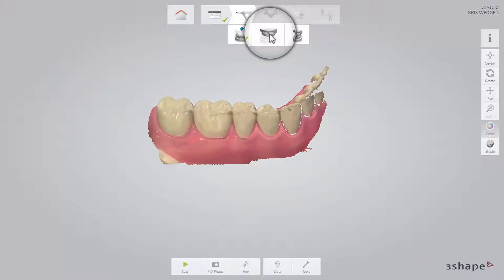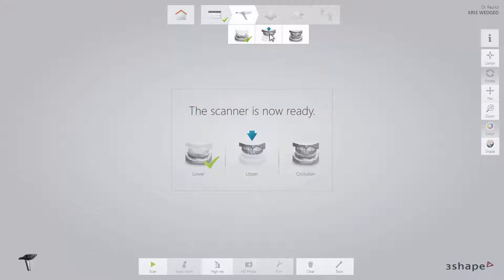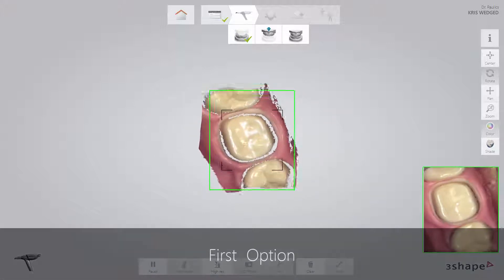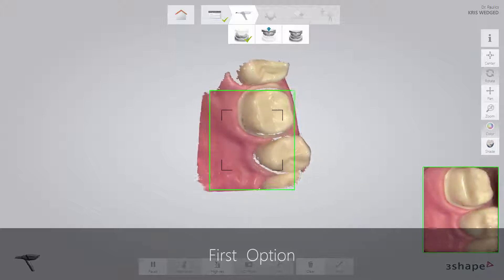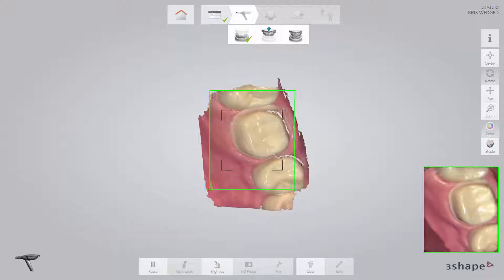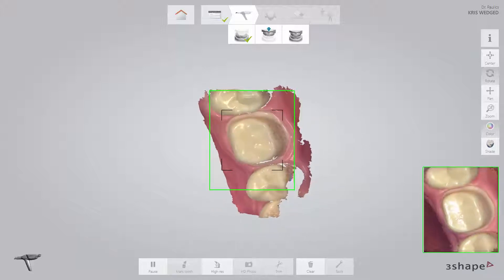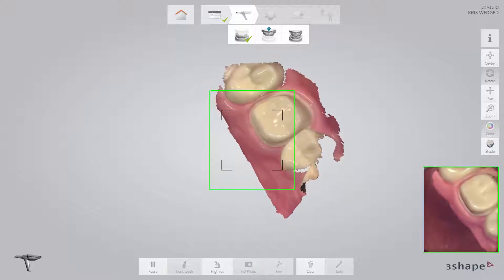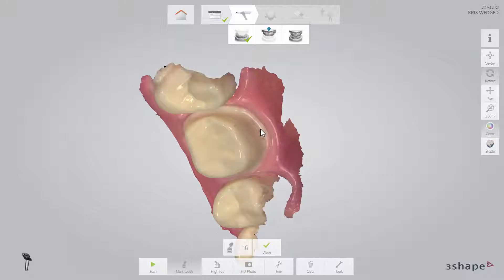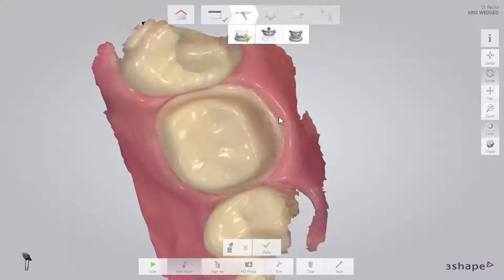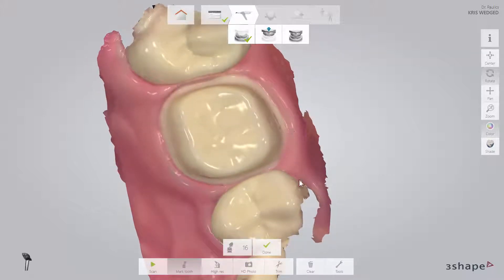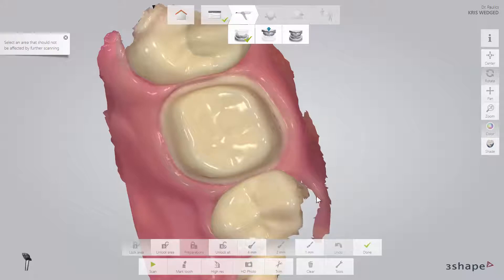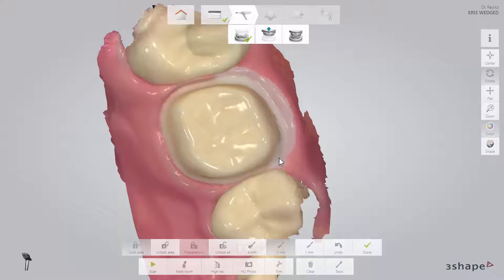Now proceed to the upper arch and scan the same area as the lower arch. There are two ways to scan an arch with a preparation. The first option is to remove the retraction cord, dry the preparation, and immediately scan the preparation with a clear margin before the gingiva collapses. Make sure to get the margin covered well. Then paint the margin using the lock tool, found under the Tools button. This will freeze the margin in its current retracted state.